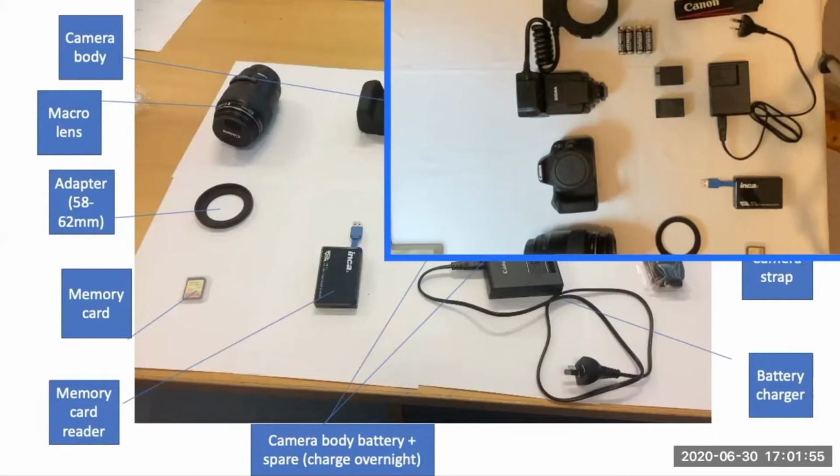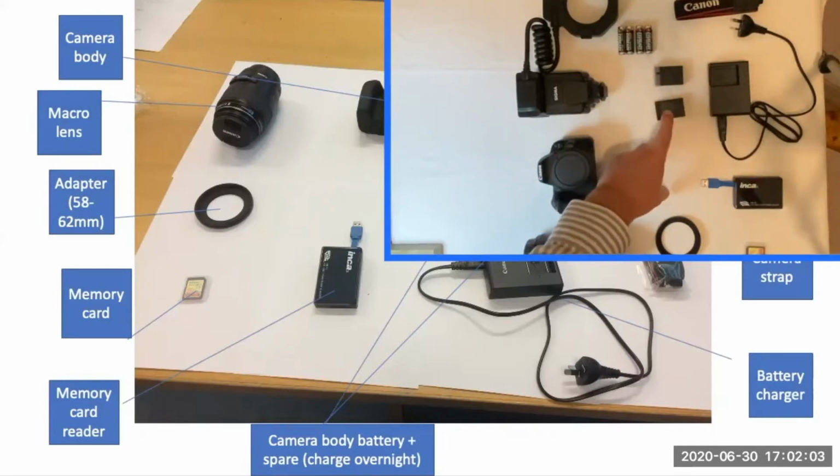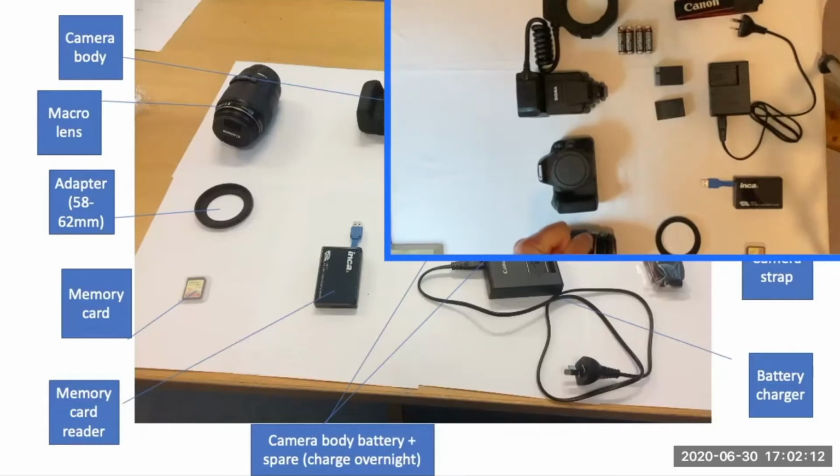Those two batteries in the middle are the batteries that go into the body of the camera, which you can use interchangeably. This here is the charger that will charge these batteries for the body of the camera. This is really critical, the ring flash adapter. So I'll show you how to stick that in.